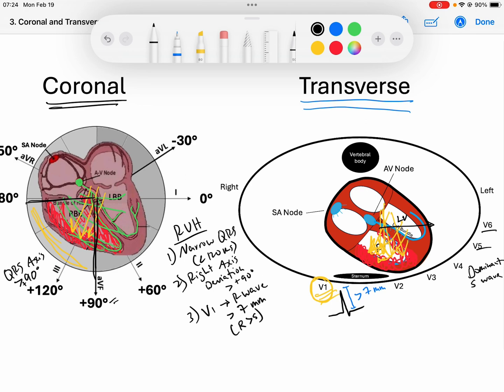Remember that ECG isn't the best for ventricular hypertrophy - an echocardiogram would be the best. I want you to focus on the most well-used criteria: in V1, those R waves that are greater than 7 millimeters or an R wave that is greater than the S wave.